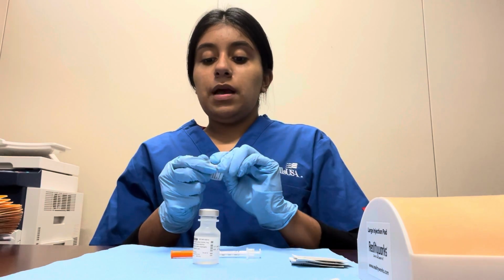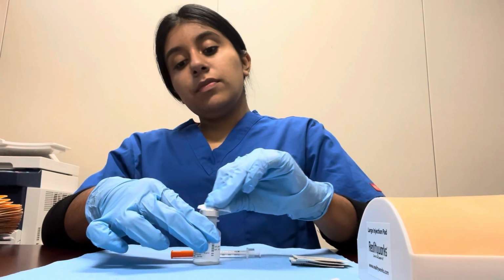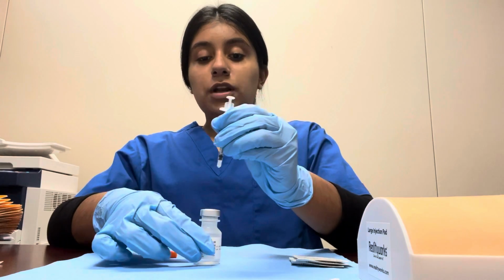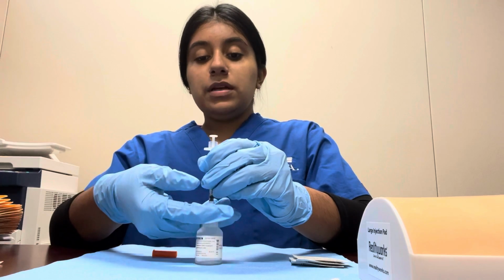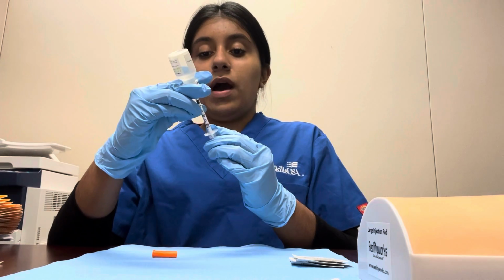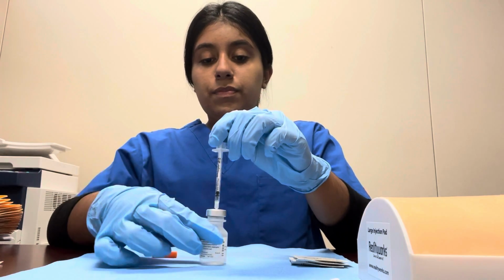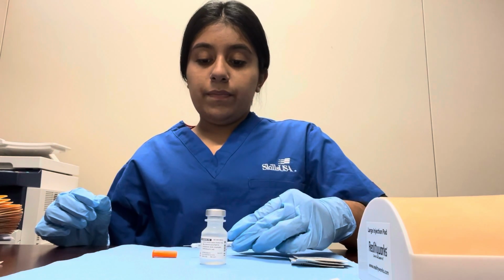I will be grabbing an alcohol prep pad and make sure to clean the vial. I will now grab the needle and carefully insert it at the top of the vial. I will then turn it upside down and pull back as many units as needed. I will be getting 5 units for this example. I will now carefully recap.